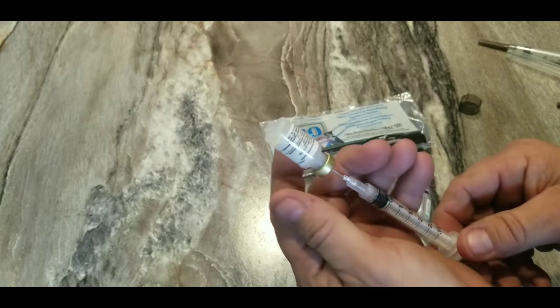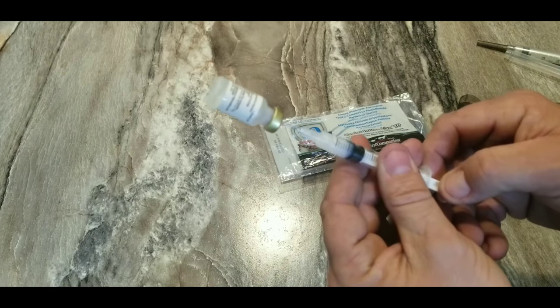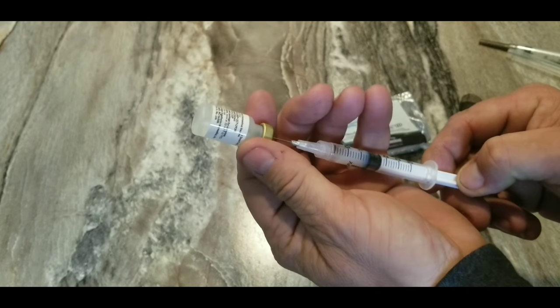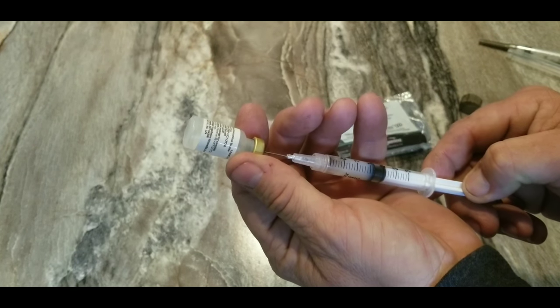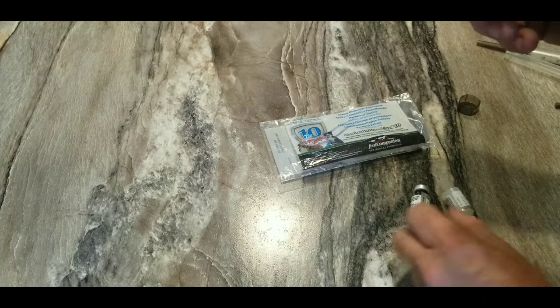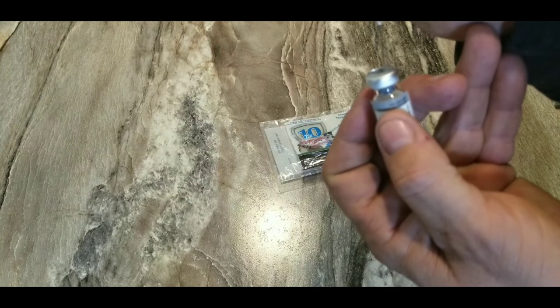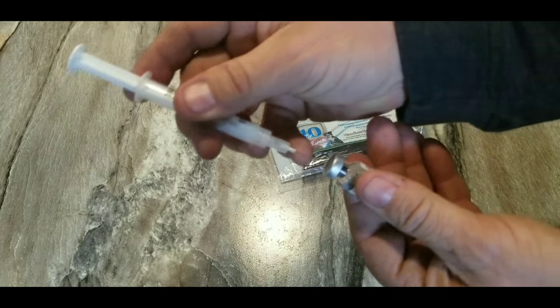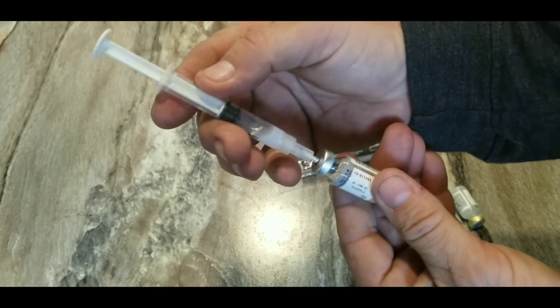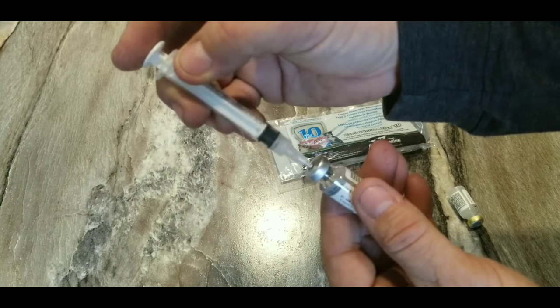You just barely stick the needle in the bottle and start the process of taking the liquid out of the bottle. You see how that worked. Now you still have suction in the bottle, so it will pull the liquid right out of there. When you stick it in, you can push it and give it a little help.